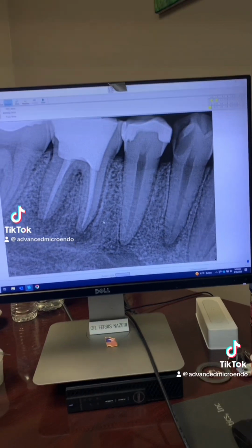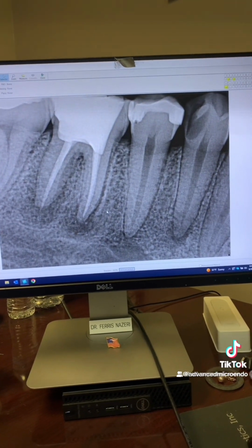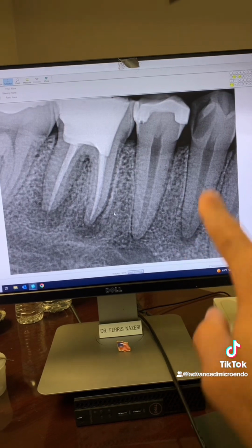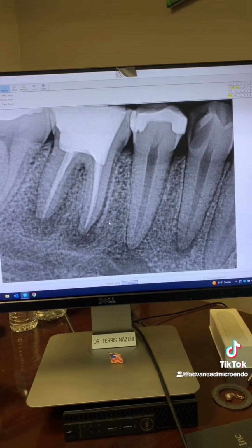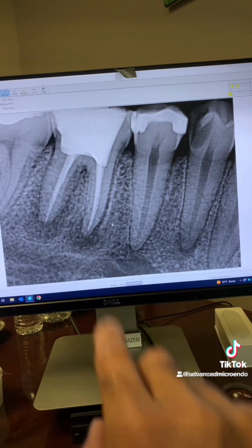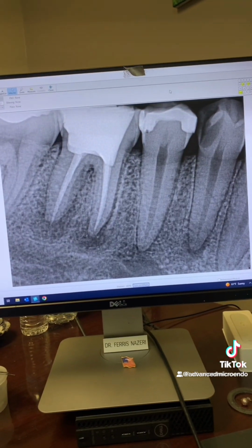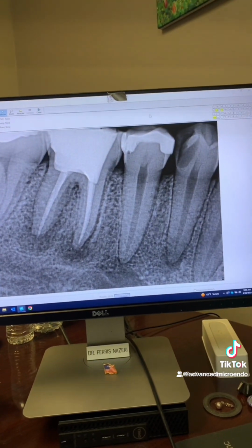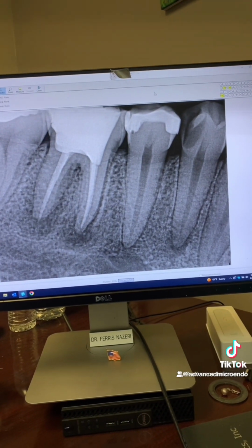Excellent. I want to talk to you guys a little bit about a couple of issues that come up sometimes. First issue that comes up sometimes is that cases such as this, teeth with periapical lucencies, you will need to do these in multiple appointments. After the first appointment, when you open the tooth up, or when you remove the gutta percha, you need to place intracanal medicament such as calcium hydroxide at least one time, temporize the tooth, bring the patient back maybe a week later, and then complete the root canal. But you will need at least 1 week of calcium hydroxide or calcium hydroxide-like intracanal medicament.